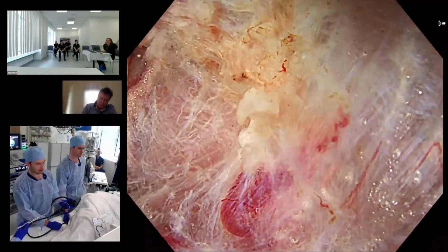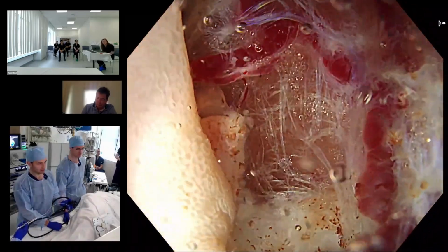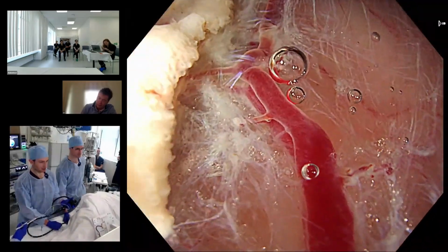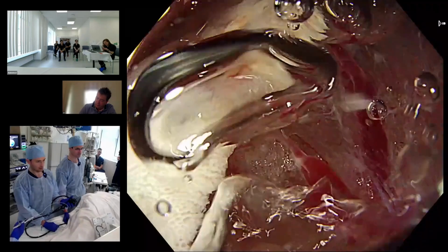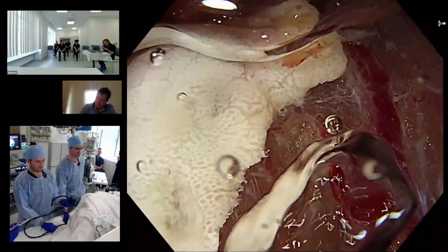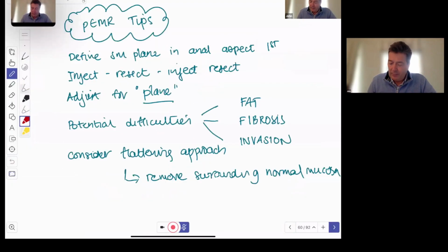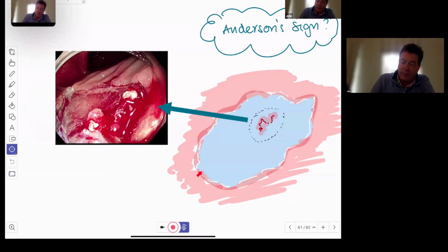We haven't really seen in there, and it speaks to the fibrosis that was here before that we really just cannot see in there. Even with a cap, even with water, we cannot see in that space easily. And the final thing, which I thought was really quite a nice example, you did fantastically well. There was a beautiful resection, and we've got this little bit of tissue in the middle.